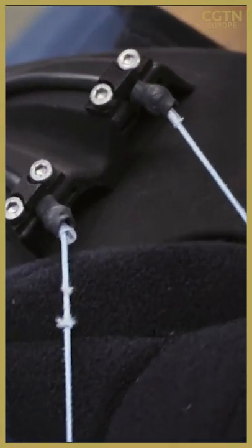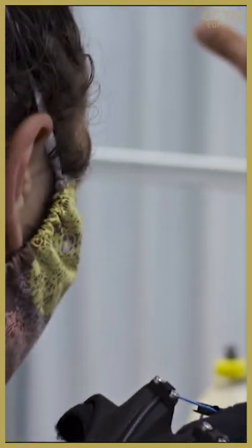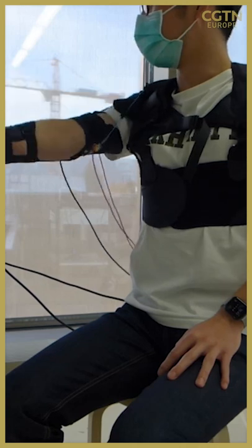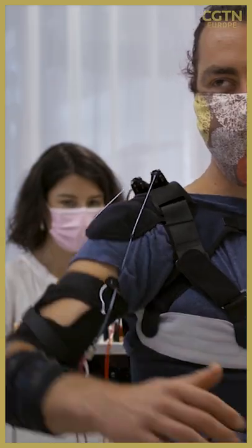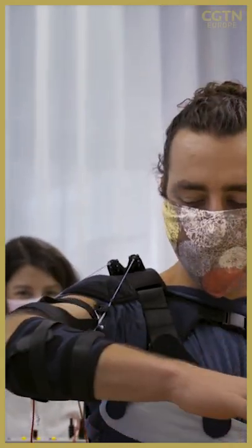An electric motor drives what we call an artificial tendon. This basically behaves like biological tendons because it is pulled by an electric motor and provides assistive force in parallel to the biological muscles.